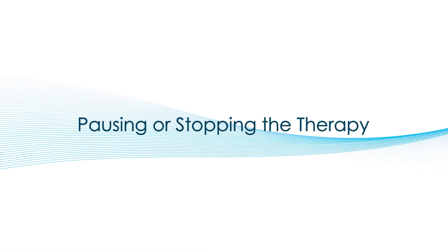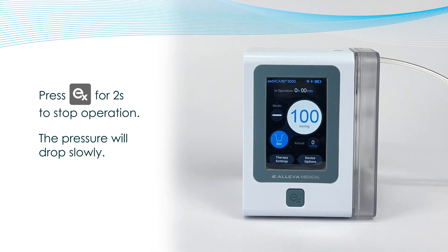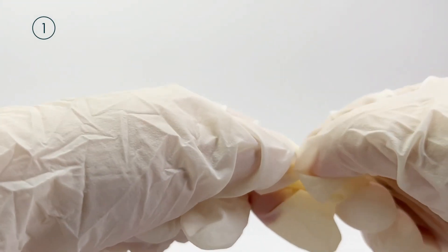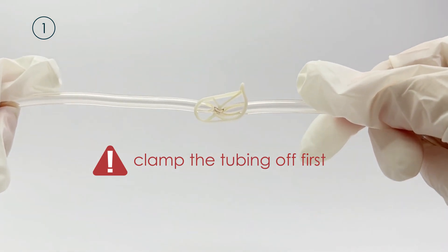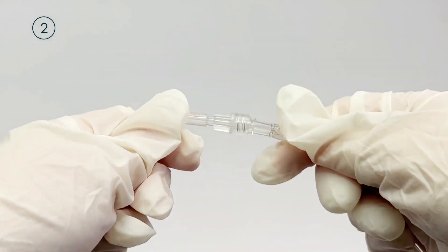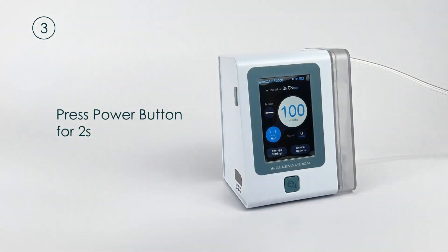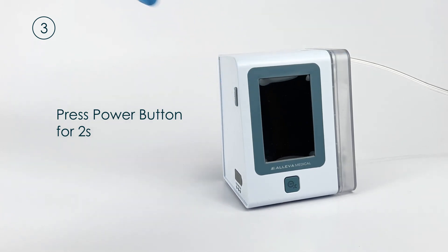Pausing or Stopping the Therapy. To pause a therapy, press the EX button for 2 seconds. To end the therapy and temporarily disconnect the patient from the unit, please use the following steps. First, use the tubing clamp to close off the dressing — this protects the wound from outside contaminants and keeps the dressing vacuum down. Second, disconnect the lure connector on the tubing. Third, press the power button for 2 seconds to turn off the pump. If necessary, dispose of the canister according to your local regulations on medical waste.